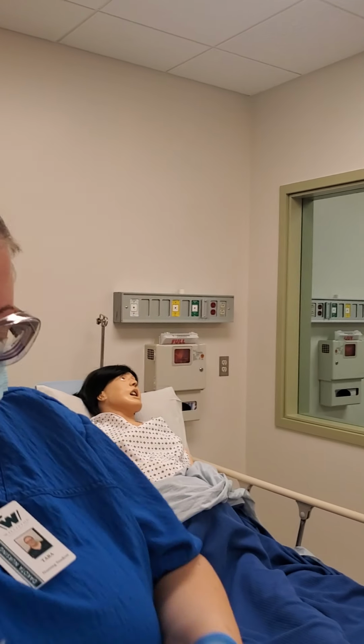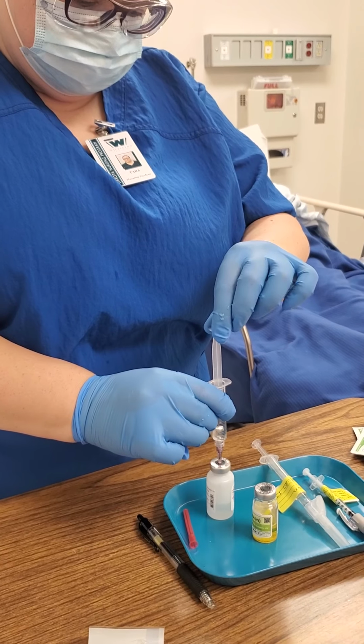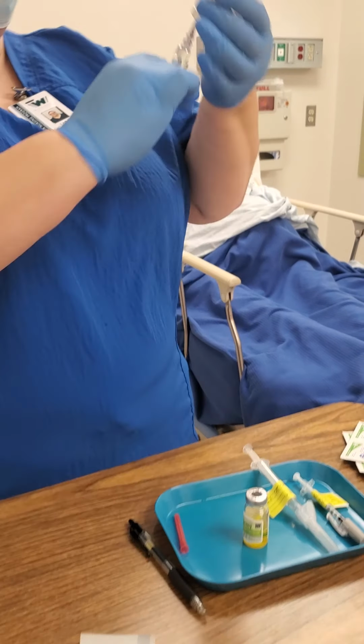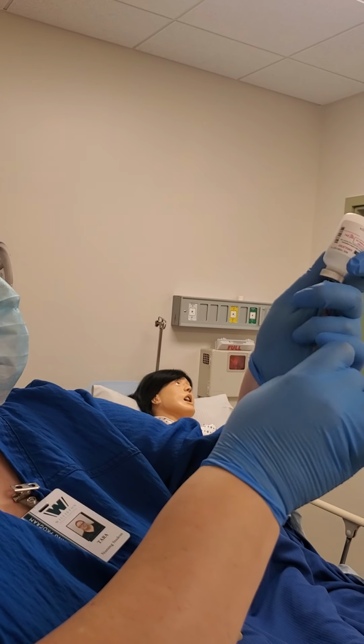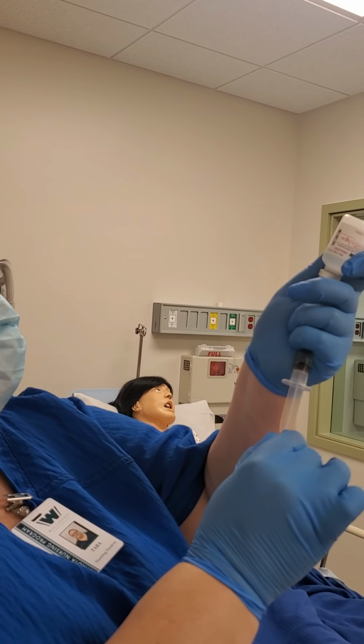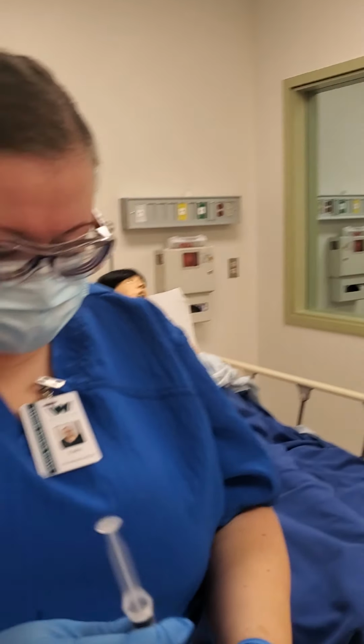No, still not enough. Because I was just withdrawing air. Good one. Okay.